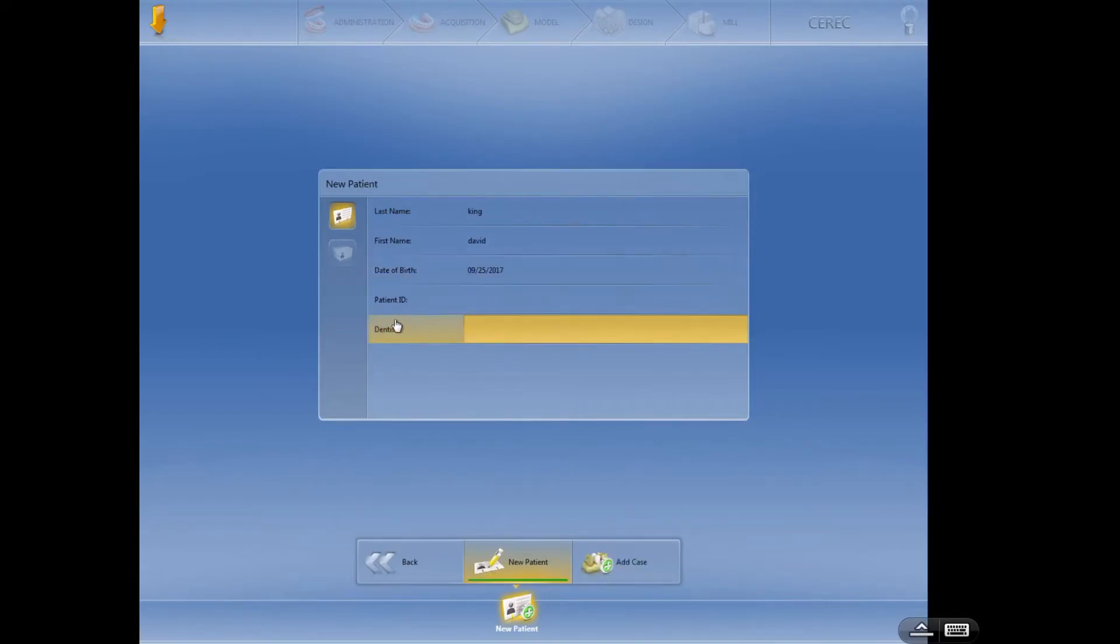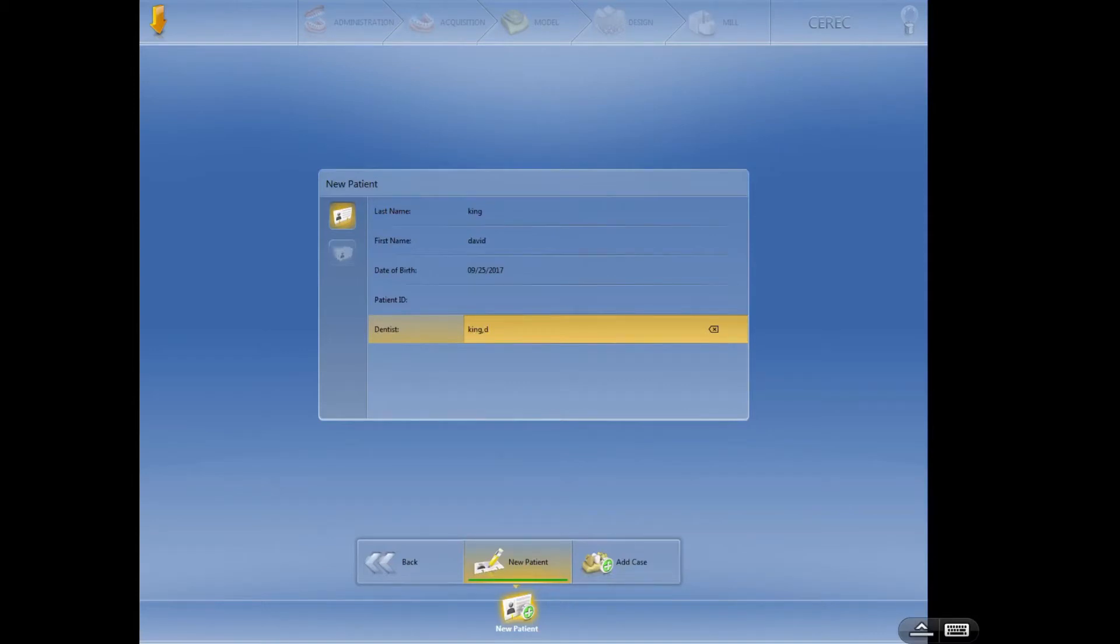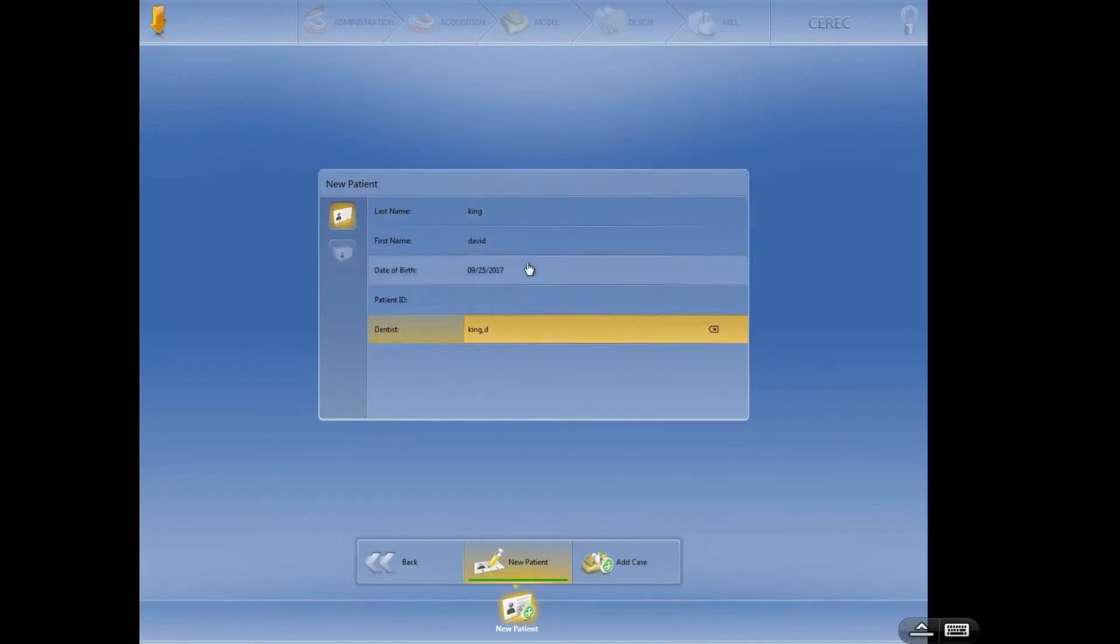And then the dentist. What I like to do is put in the last name of the dentist, comma, the first initial. That's pretty clear. Whatever you do, you want to get on the same page with everybody in the practice so you don't have 25 different Dr. Kings listed in the software. At some point I hope that CEREC will allow us to put in a list of providers and then just click the provider rather than adding a bunch of different providers with each patient.